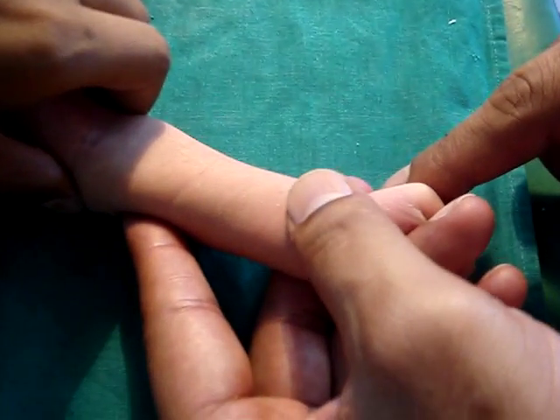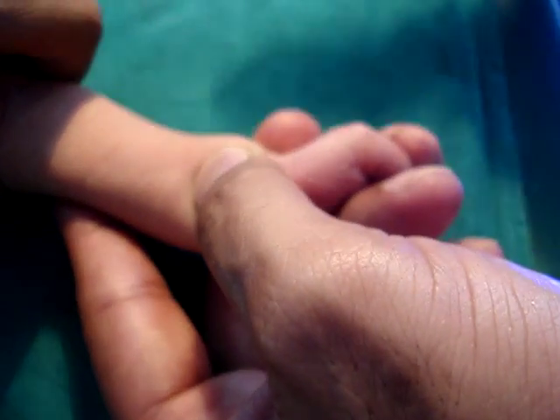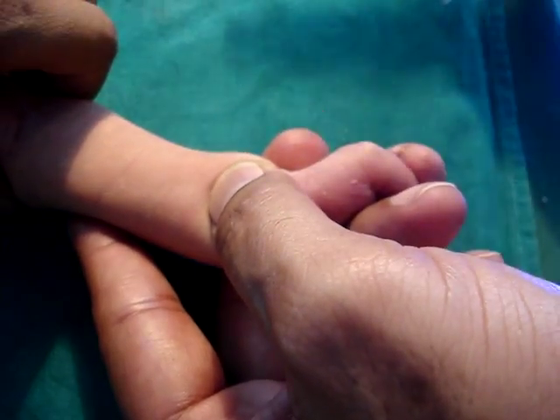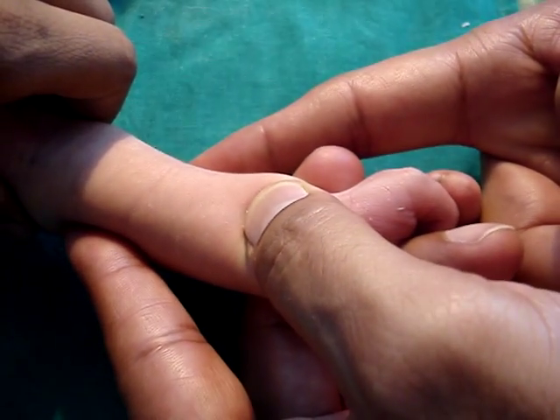Pressure is applied for about 30 seconds with the thumb over the lower end of the radius, and light is thrown tangentially from one side so that a shadow of the radial artery is formed when it becomes prominent.